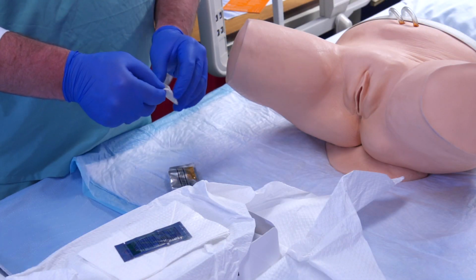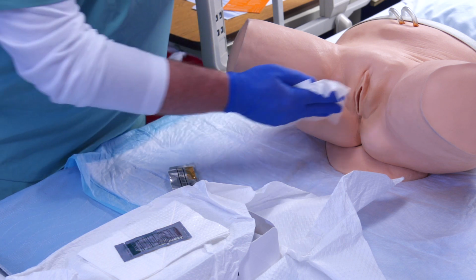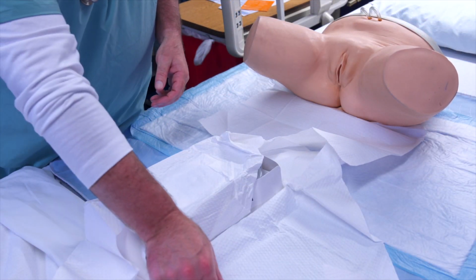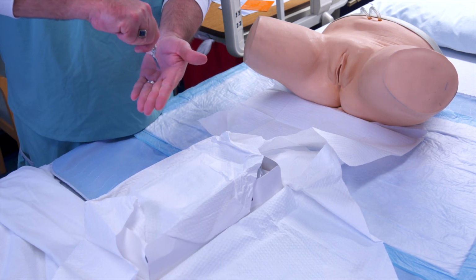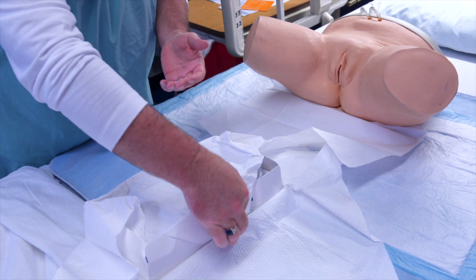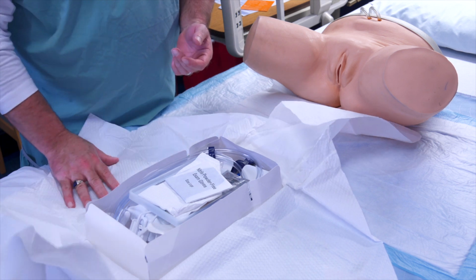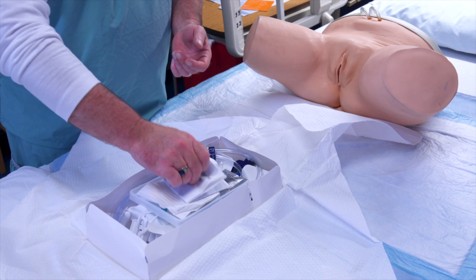Retrieve the Castile soap provided or use what is designated by your facility's protocol and cleanse the perineal area. Remove and dispose of non-sterile gloves and perform hand hygiene using the provided hand sanitizer. Don sterile gloves provided in the closed system tray. Always keep your hands above your waist and in front of you. Do not touch anything that is not sterile.